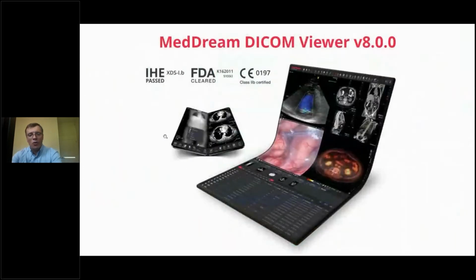Yes, and now what's next? Next is version 8. As you see, this is a turning point. We are finishing version 7 with this version, and we believe it is actually the most successful cycle for our team.